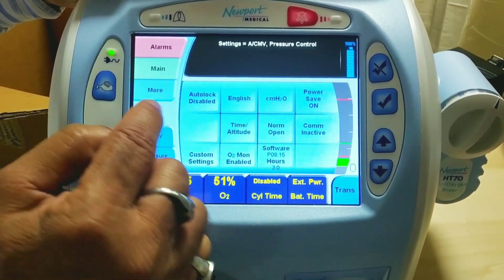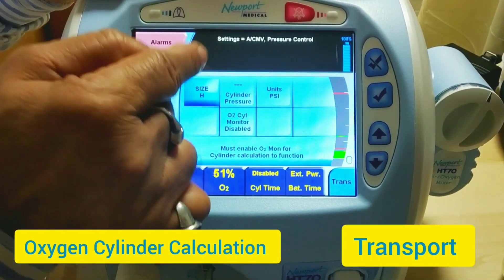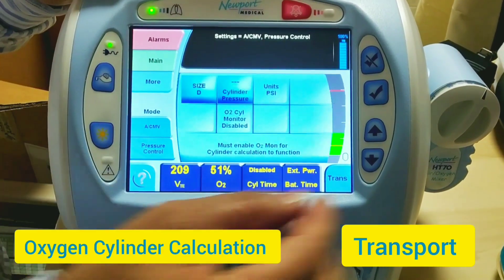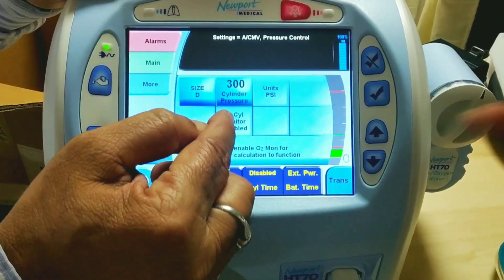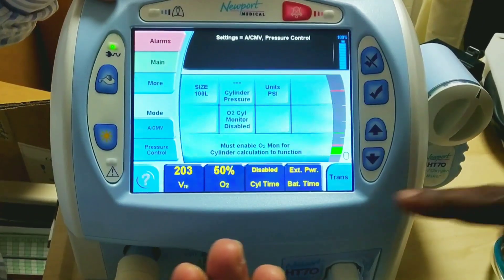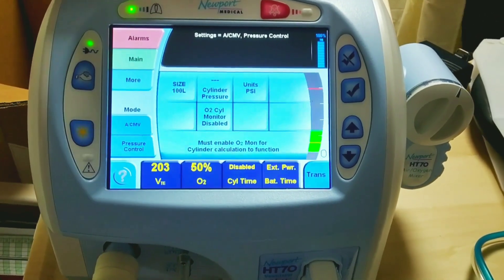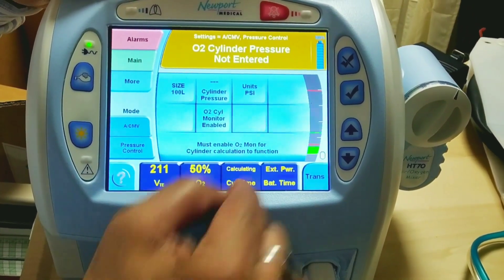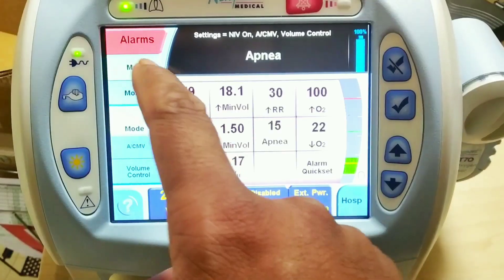For transportation purposes, we need to calculate oxygen cylinder consumption. Set the cylinder size by repeatedly pressing to cycle through cylinder types — all sizes are listed. Adjust the cylinder pressure using the up/down keys and the consumption gets recorded accordingly. The transport mode is activated and it stores the cylinder data. Pressing any of the four keys on the bottom will bring up a screen where you can view the relevant data.